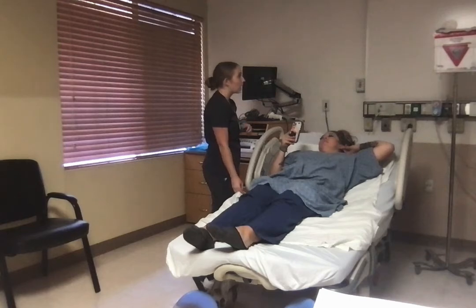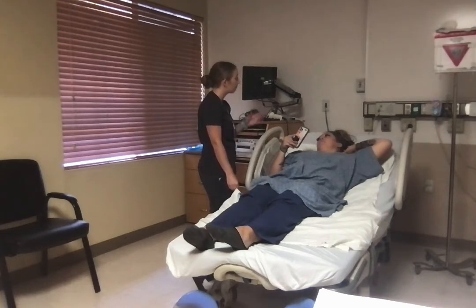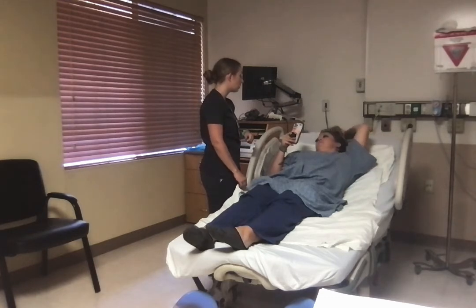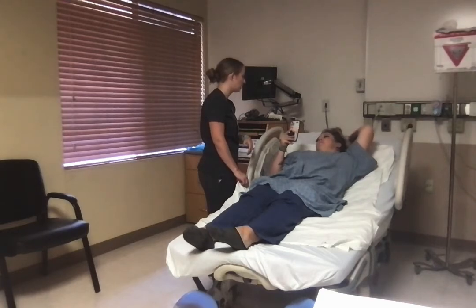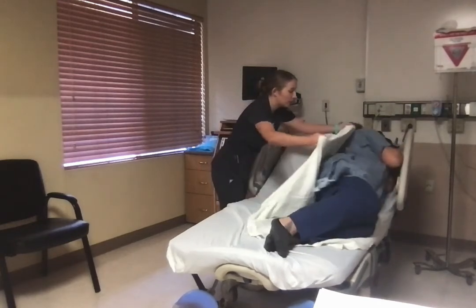Baby is fine right now, so a decel is when the baby's heart rate goes down 15 beats per minute at least from their baseline, and that can happen with or without contractions. But what I think is happening right now is that baby is either laying on the cord or holding the cord that's making its heart rate go down. Okay. So let's go ahead and reposition you on your left side. 1, 2, 3.